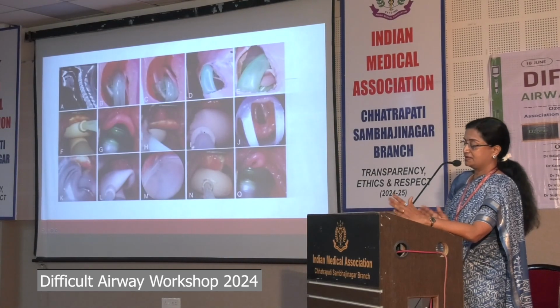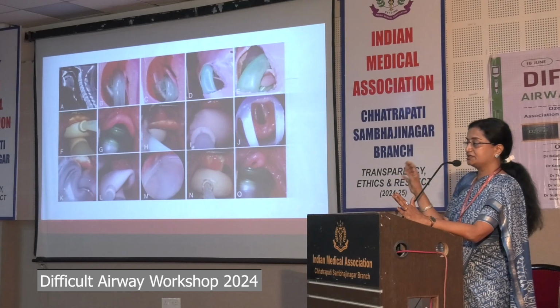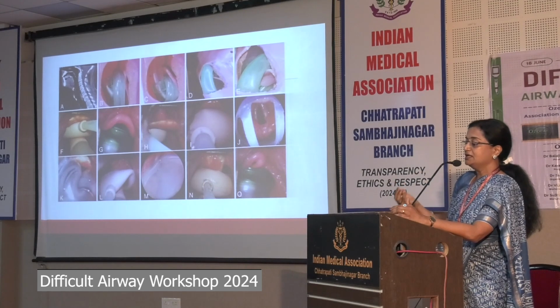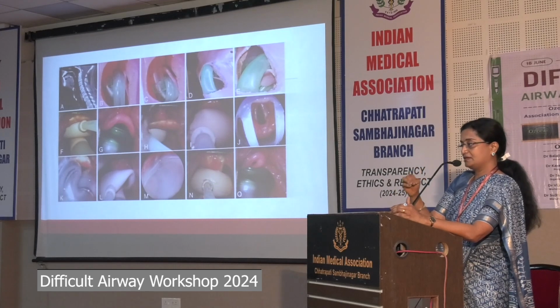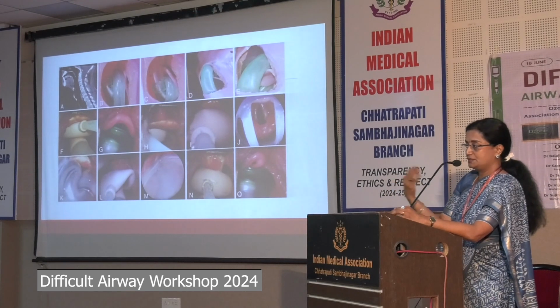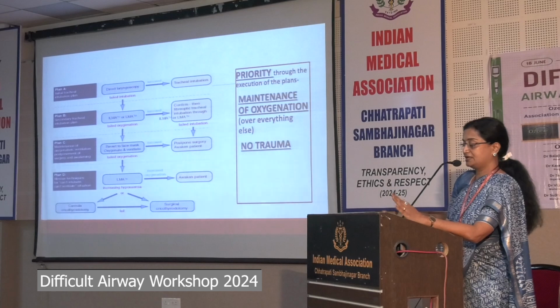While keeping an SGD, you have to remember that it's a very forgiving device. You will get good graph, ventilation graph and everything, but if there is misplacement, it will not show very easily. So you have to keep in mind that in a difficult airway, gastric insufflation can occur. There is a chance. So you have to understand that and keep a watch for that. Otherwise, you'll be landing from the frying pan into the fire because you do not want aspiration at this level.